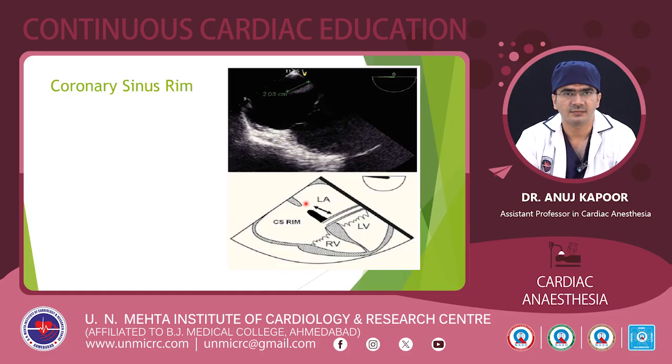Now the coronary sinus rim. The coronary sinus rim is visualized when we insert the probe slightly deeper from the mid-esophageal four-chamber view. When we visualize the coronary sinus, we will get the rim, and we can get the measurement for that. Here in both these pictures, we can get the measurement for this coronary sinus rim. It is necessary to perform a slight retroflexion of the probe to obtain a view of both the lower end of the ASD and the coronary sinus.